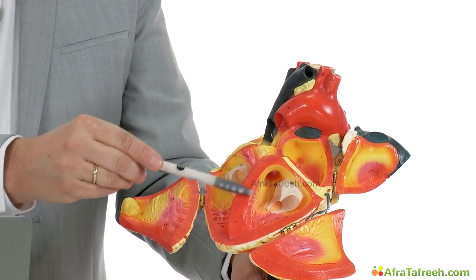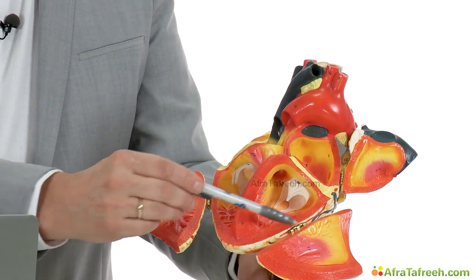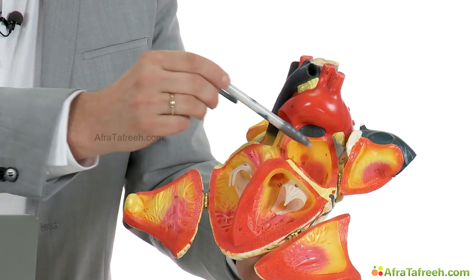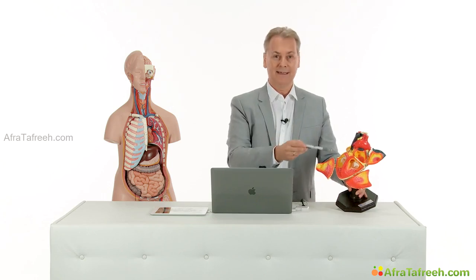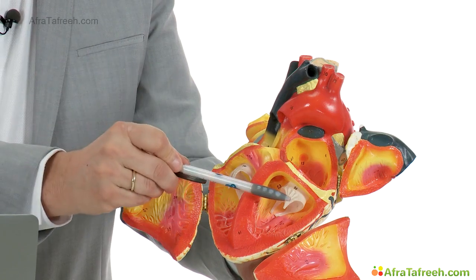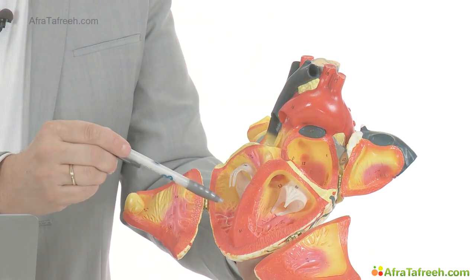The interventricular septum is a very prominent structure. The wall of the right ventricle is not nearly as thick as that of the left ventricle. In this view, you can actually see the left ventricle, the right ventricle, the left atrium, and the right atrium. We're going to show you a view which mimics exactly this display here on the model. In addition, we're going to show you a view where we cut through the ventricles right here, perpendicular to the interventricular septum, displaying the left ventricle and the right ventricle.